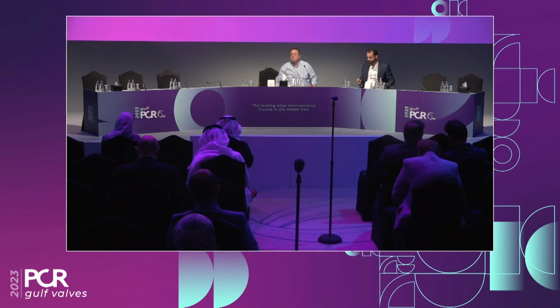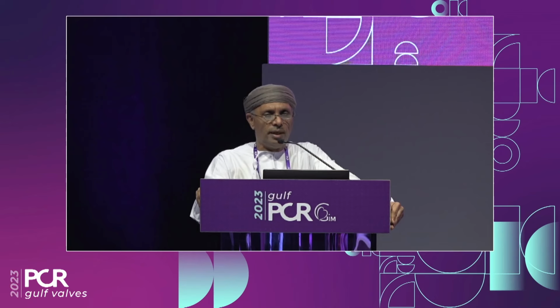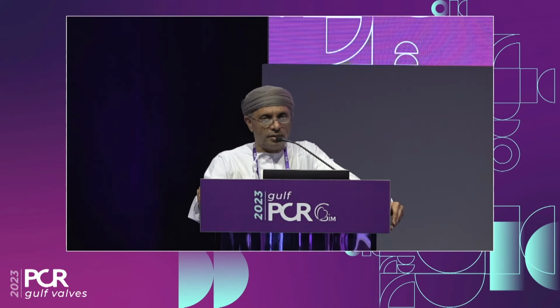Dr. Mohani, conclusion? There's nothing to say. I presented these 2 cases just to show the advantages of having a Navitor system. In each lab, when you are starting, just keep yourself familiar with 1 or 2 platforms. Don't distract yourself with many platforms. There is no one platform which is suitable for every single anatomy. But as I said, start with one or two, and keep yourself familiar with them.